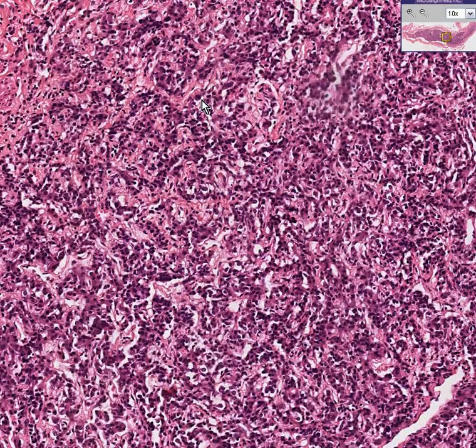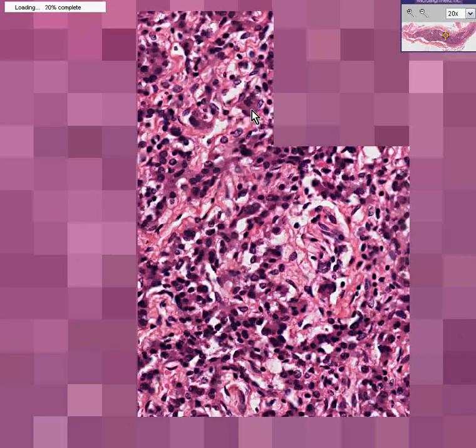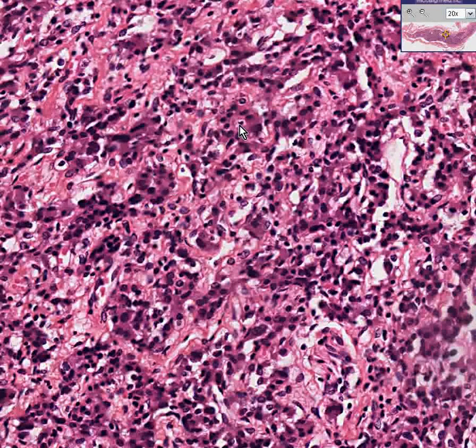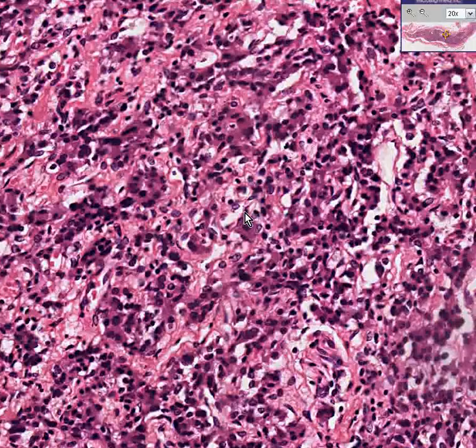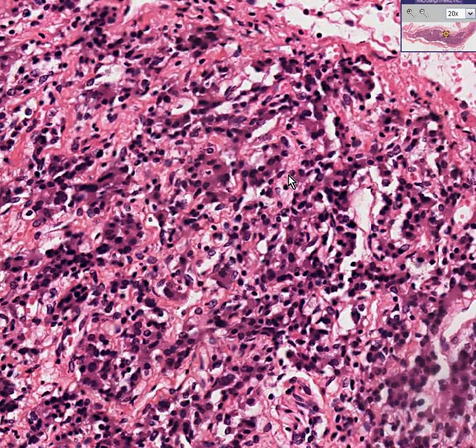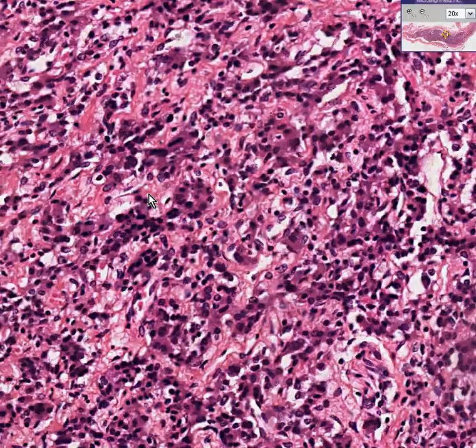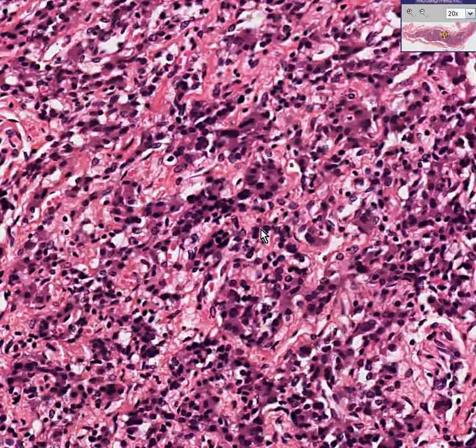And why is that? Well, perhaps maybe you can see some small structures which you could differentiate as glands, like here, in here, in here, perhaps a little trace here, in here, but they don't seem to differentiate into glomerular areas or zona glomerulosa peripherally, or linear fascicles in the middle, zona fasciculata, or sort of reticulated cord-like structures. They all seem to be about the same.